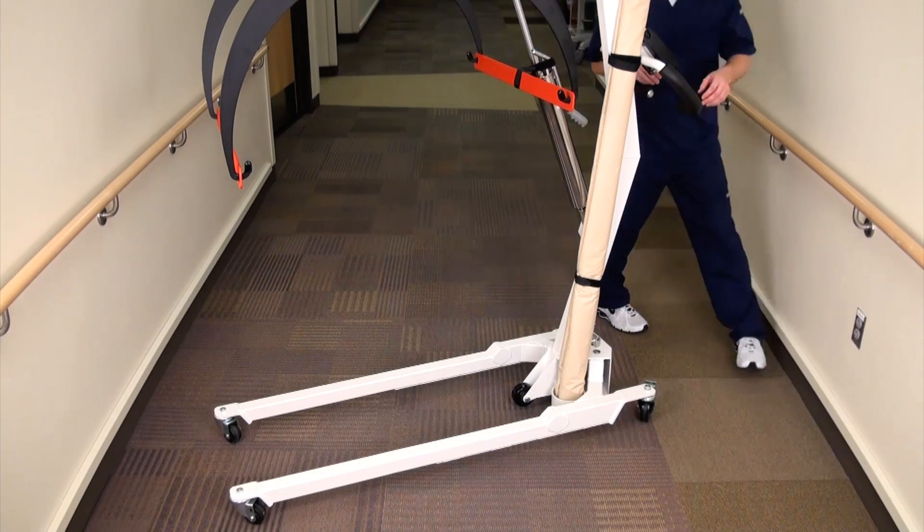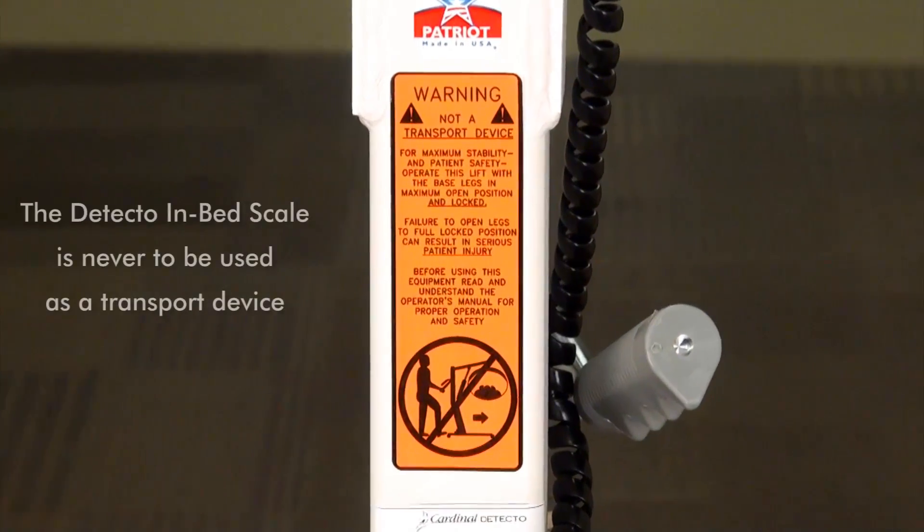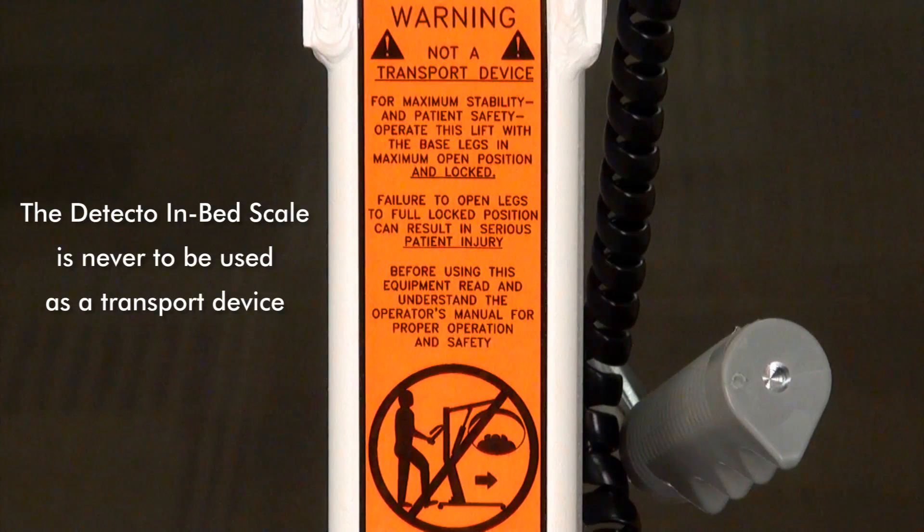The Detecto in-bed scale is ready for transport to the next patient's room. Keep in mind, the Detecto in-bed scale is never to be used as a transport device under any circumstances. Damage to the scale and harm to the patient may result if it is used in this manner.